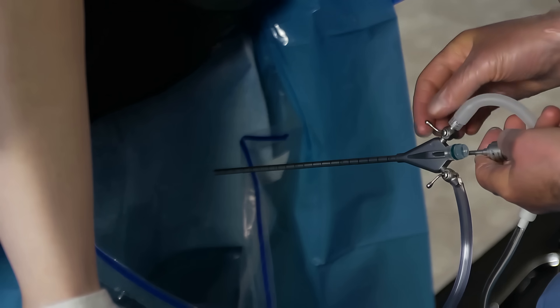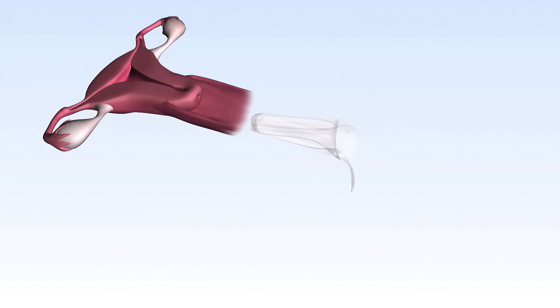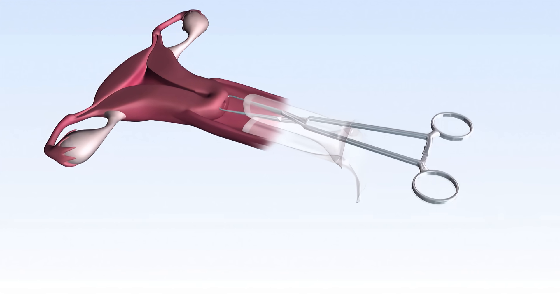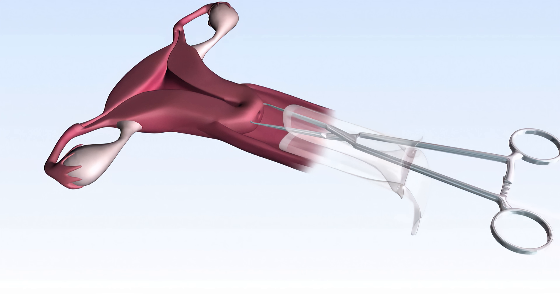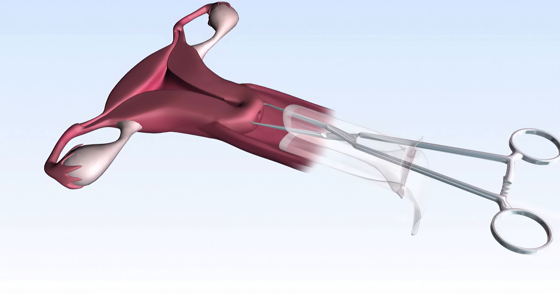Draping is now performed. At this point, fluid should be flushed through the hysteroscope into the buttock drape. A time-out procedure is performed, confirming that the patient understands the nature of the procedure and any other checklists are performed. A speculum is then reintroduced into the vaginal canal and the cervix is visualized. A single-tooth tenaculum may be used to assist in straightening the uterus during the insertion of the hysteroscope. If this is the case, a local anesthetic may be applied at the anterior lip of the cervix to provide anesthesia.